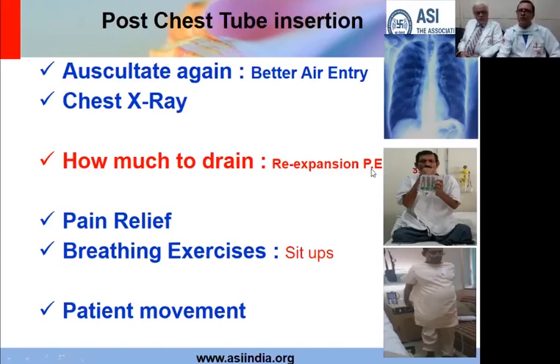Now, how much to drain? If there is too much fluid inside and the lung has been collapsed for some time, if you put a tube and drain the entire fluid completely and the lung expands suddenly, sometimes patients can go into pulmonary edema, what is known as re-expansion pulmonary edema. So it's always important to let the lung expand slowly.